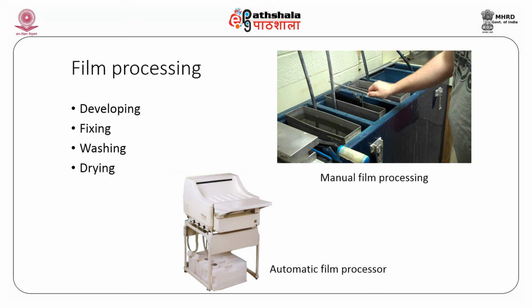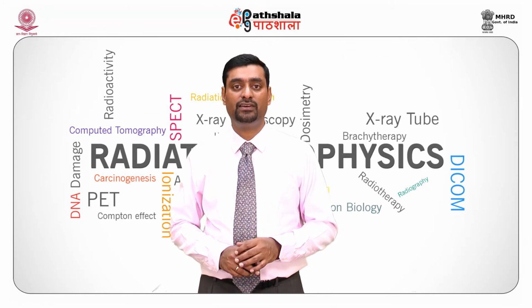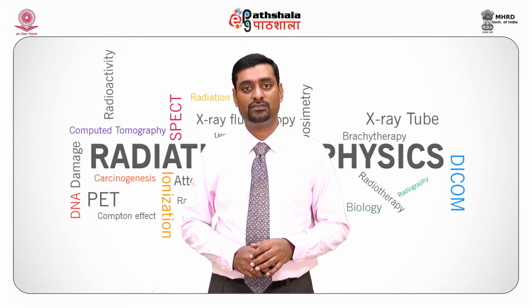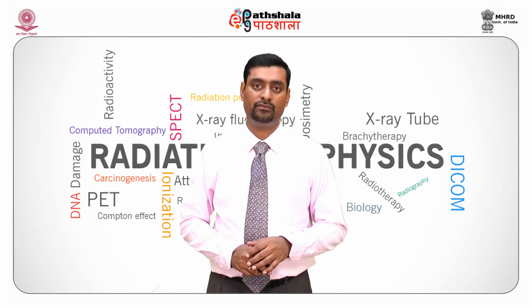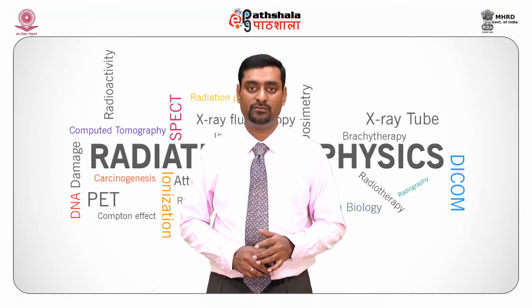Film processing has 4 steps. One is developing, second one is fixing, washing and drying. And finally, the image after drying is used to visualize on high grade monitors, on view boxes. These are also called light boxes, or view box is an appropriate name.